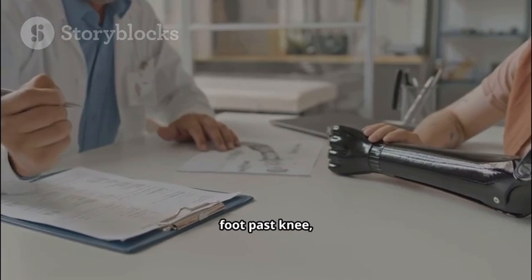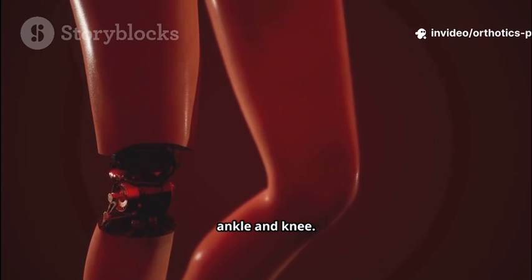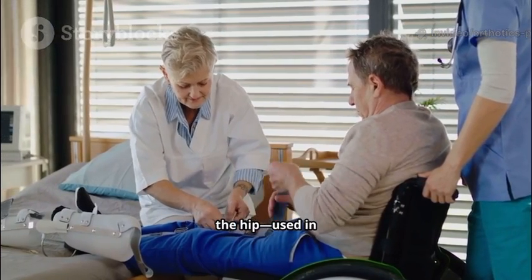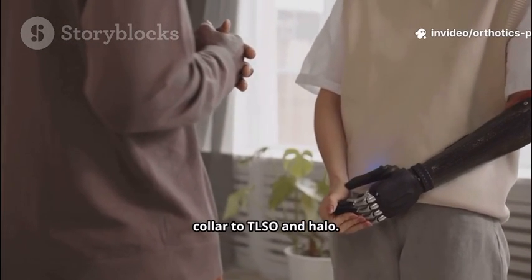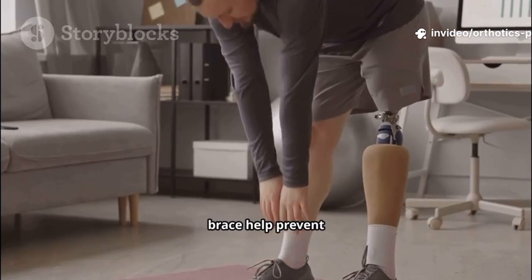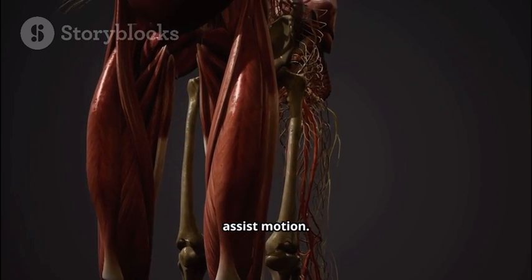KAFOs extend from foot past knee, adding stability for standing and walking. They're used with weakness or instability at both ankle and knee. HKAFOs add a pelvic section to control the hip, used in significant paralysis. Spinal orthoses support or immobilize the spine, from soft collar to TLSO and halo. Scoliosis braces like the Boston brace help prevent curve progression. Upper limb orthoses range from simple wrist splints to dynamic splints that assist motion.